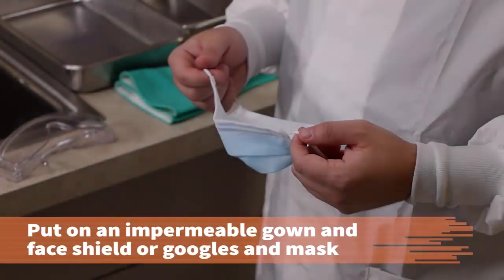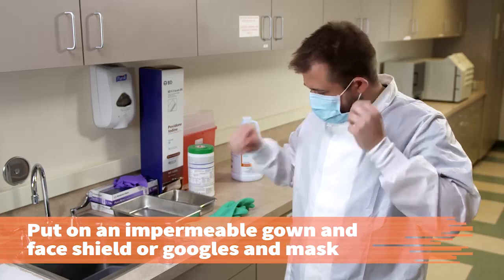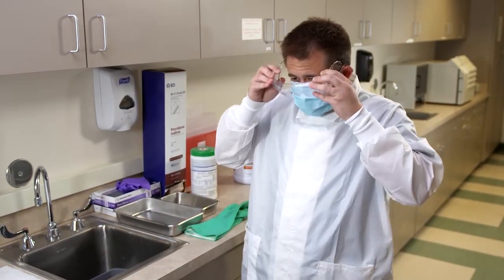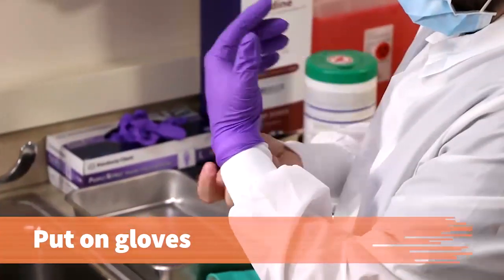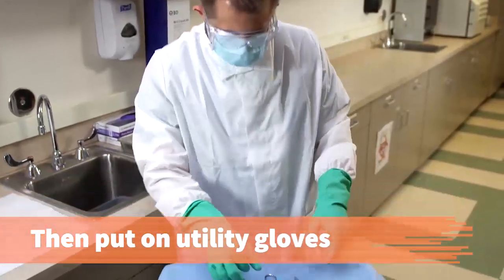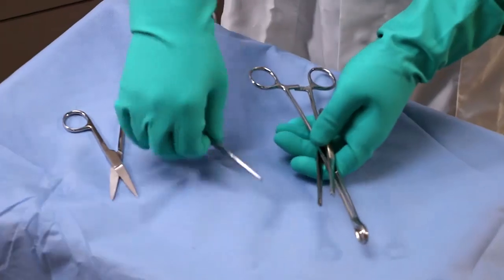Because of the potential for splashing of infectious material, put on an impermeable gown and face shield or goggles and mask. This is called personal protective equipment or PPE. Put on a pair of disposable exam gloves followed by a pair of utility gloves to protect against potentially infectious matter and sharp instruments.